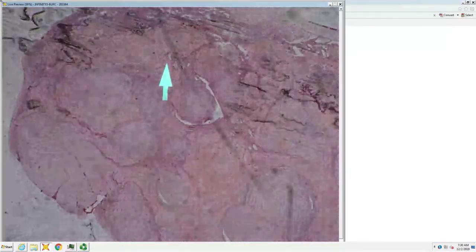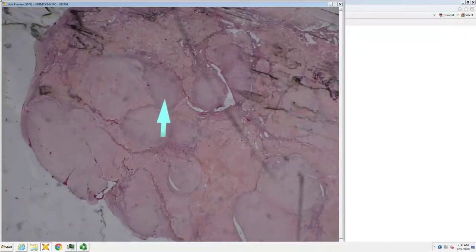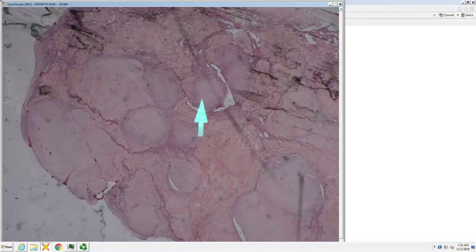Adult myofibroma. So you have these bluish nodules. They tend to have the same color to them as desmoplastic fibroblastoma, but instead of being a very uniform hypocellular tumor, you have hypocellular blue nodules surrounded by highly vascular spindle cell proliferation that is hypercellular, often with antler-like vascular spaces resembling so-called hemangiopericytoma.